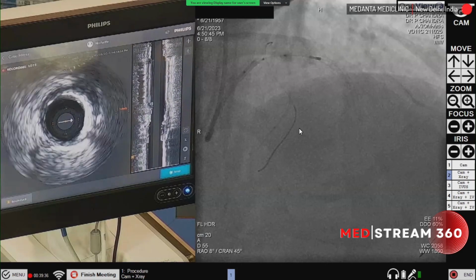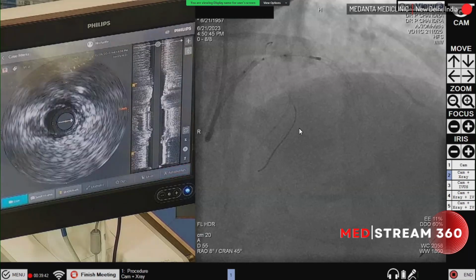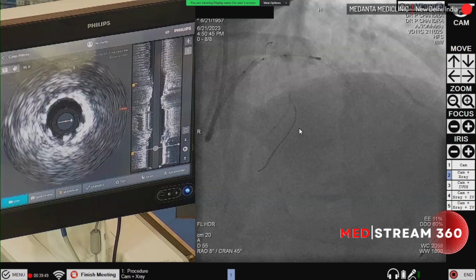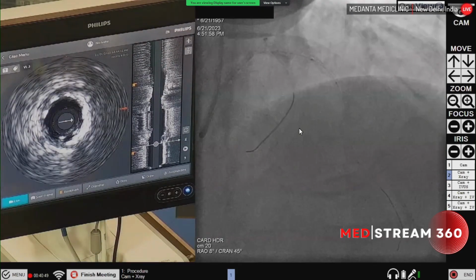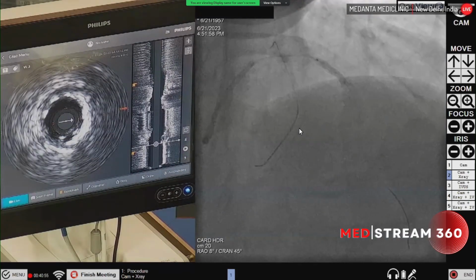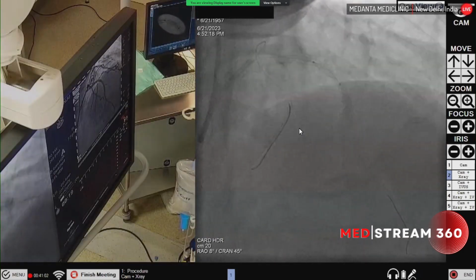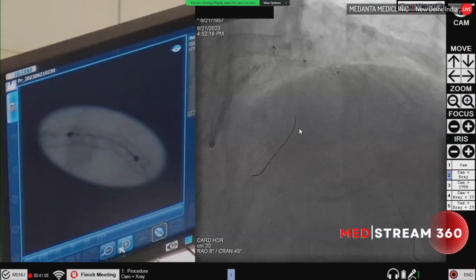And landing is also set. So here we can do some dilatation with a 3 mm balloon because there's a little bit of stent hanging there. Stent starts. I'll take a 3 mm balloon and do the post dilatation. Okay. Go up. 2, 4, 6, 8, 9, 10. Okay, deflate. So we have done the dilatation with a 3 mm balloon in the distal segment first, and then we will go to slightly higher pressures here because this is a segment which is having a good size.